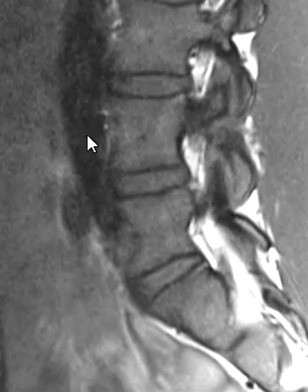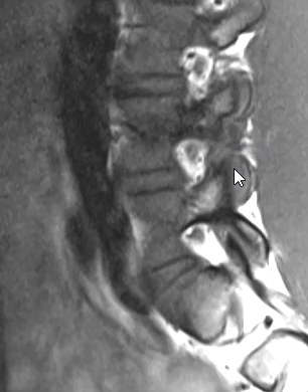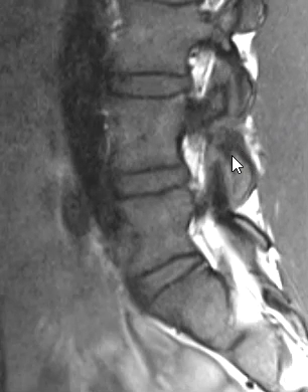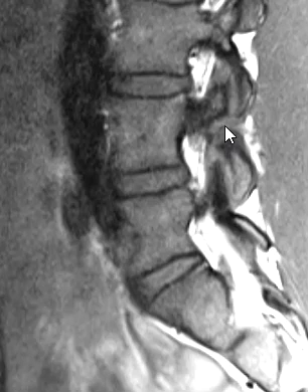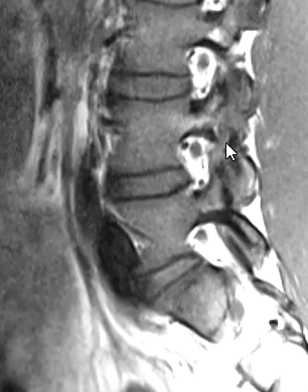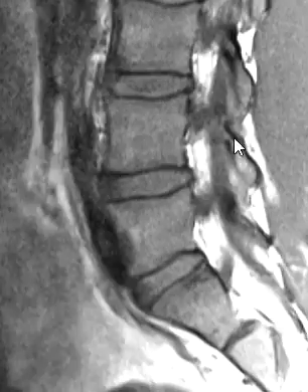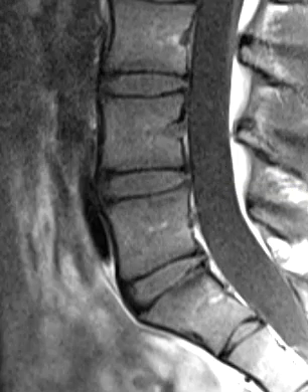This is another sequence where the marrow looks a little bit different. There is a PARS defect on one side — kind of foggy and hard to appreciate — but right here it shows up much better. This is the PARS fracture, and there's a little bit of bony separation. These two pieces of bone should be touching each other. Going off to the other side, another little gap right here. So bilateral L5 PARS defects, and otherwise a normal lumbar spine.